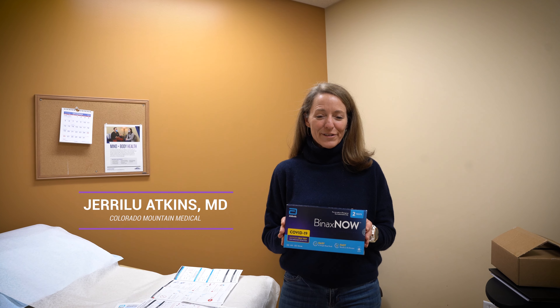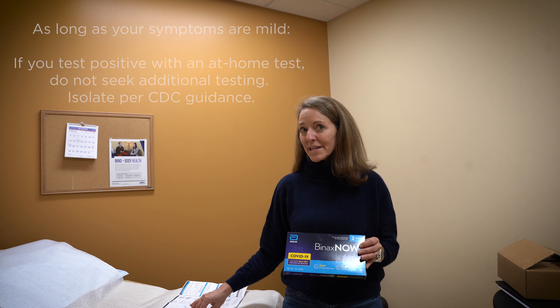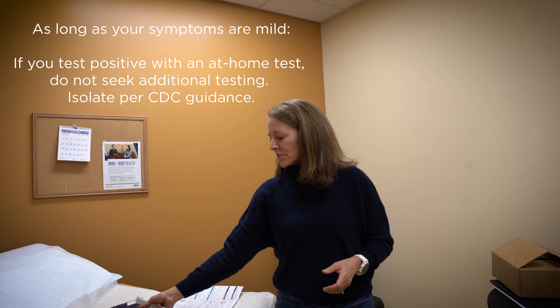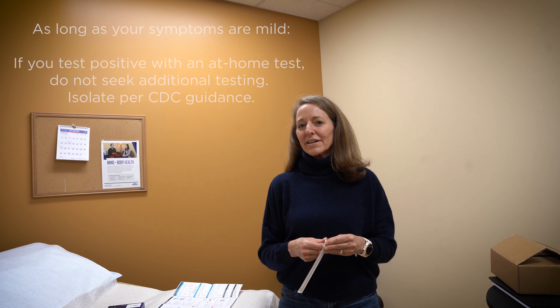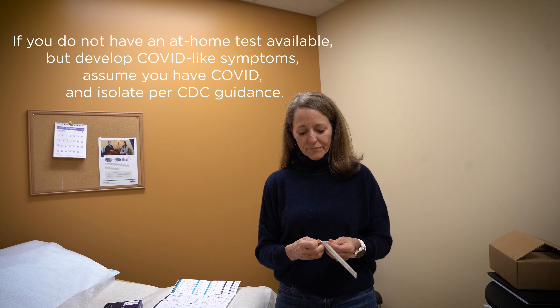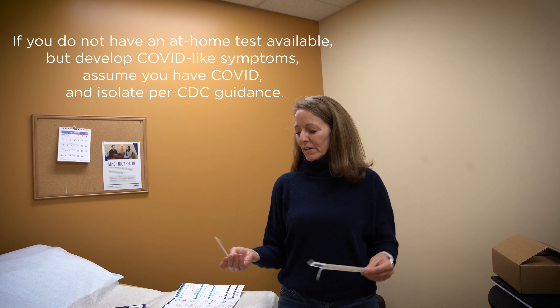Hey guys, I'm Dr. Atkins, one of the family practice doctors with Colorado Mountain Medical. I'm here to demonstrate the proper use of home testing kits — Binax is one example — and to show you how to do it in such a way that we have the best chance of getting an accurate result. We found some inconsistencies in the results, and we know that it works better if you swab your throat and your nose.